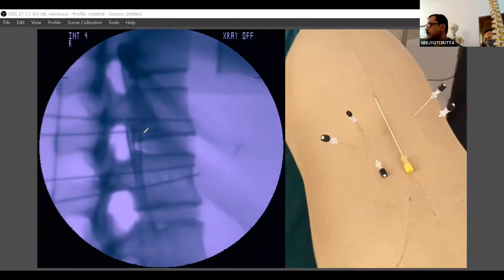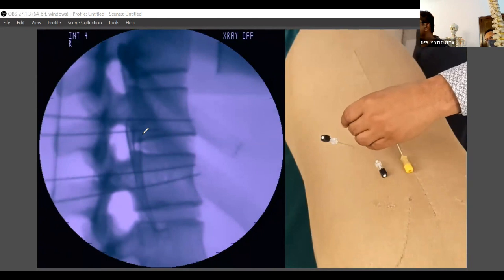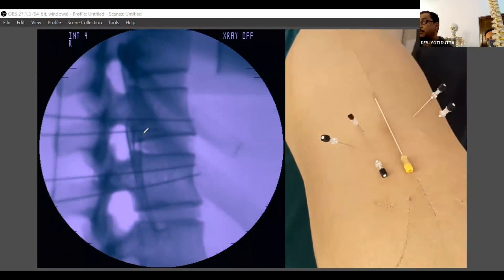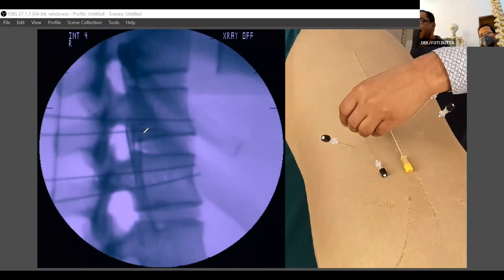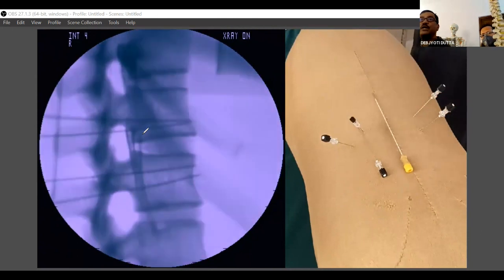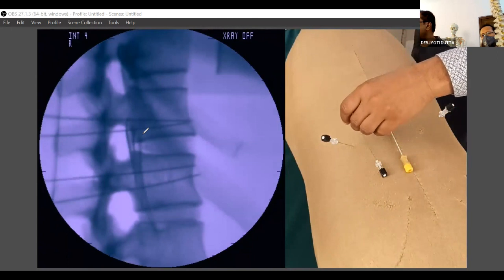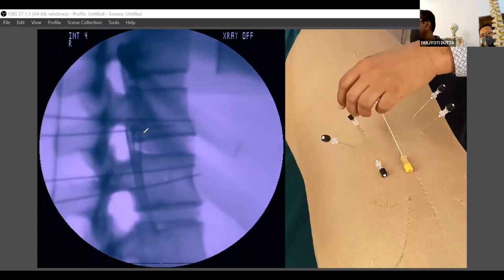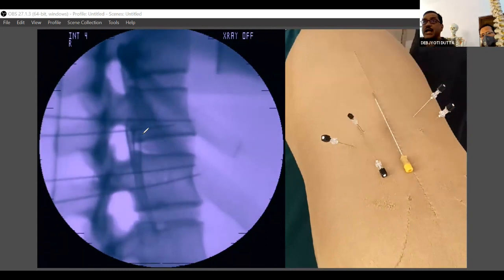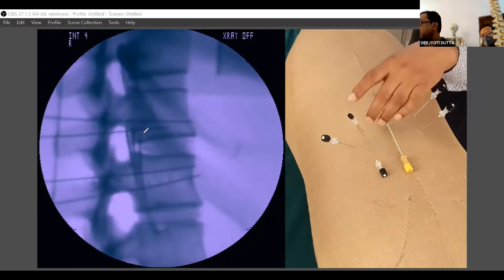Okay, so this is my needle, which is here. I'll be advancing, and what is very important when you are giving the exam is that the examiner will be seeing whether I am touching the vertebral body. So it should be scratching the vertebral body. And I am going anterior. How much should I go anterior? Not that much. That is for the retrocrural celiac plexus block. Here I'll be there just this much. That means the junction of the anterior 1/3 and posterior 2/3.